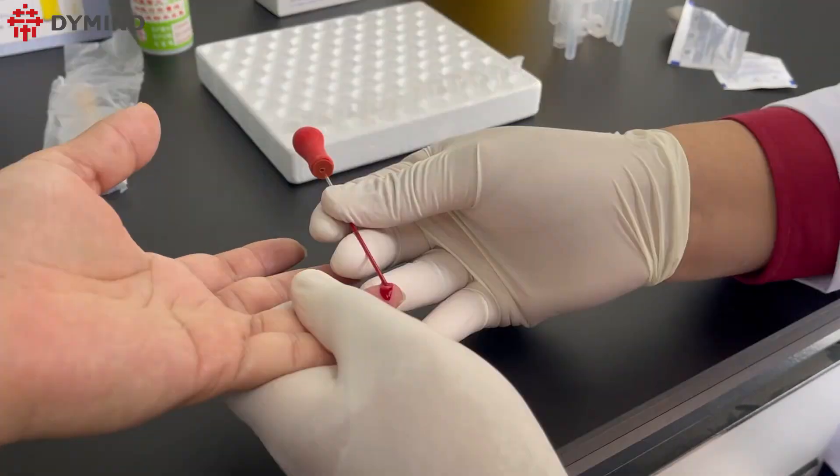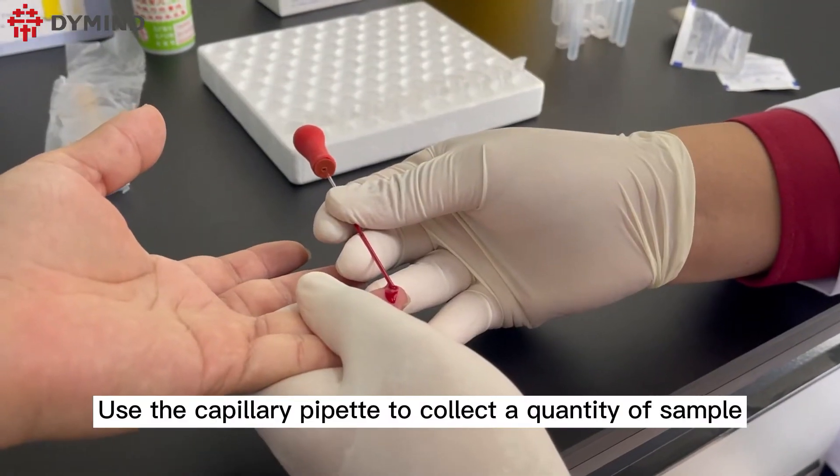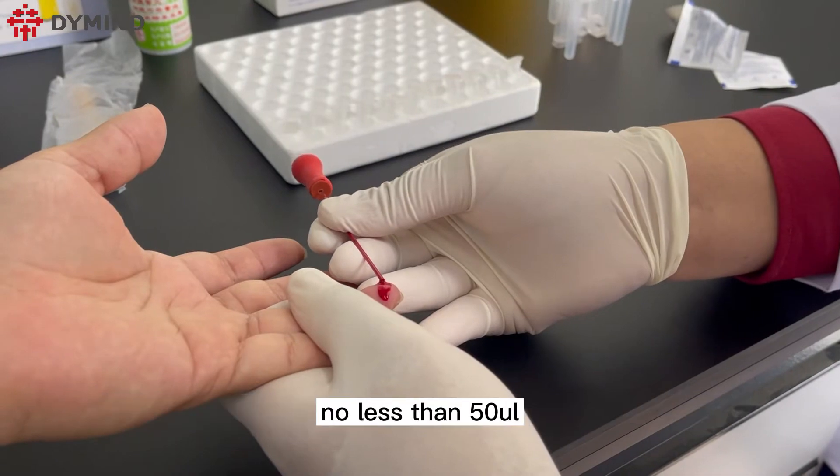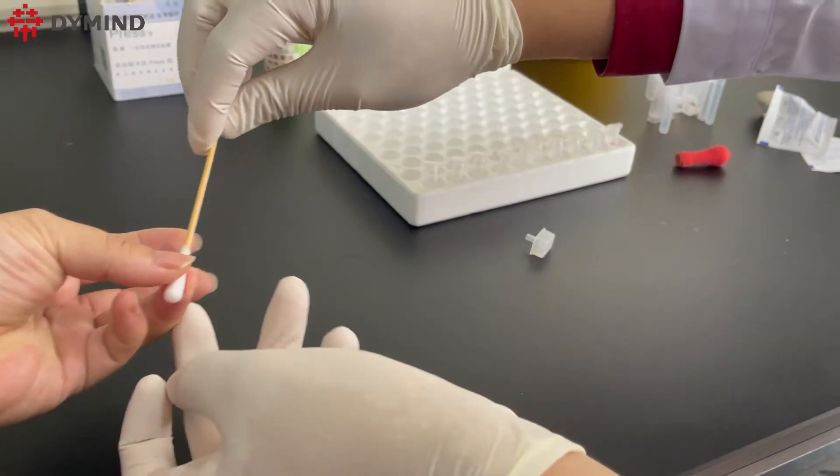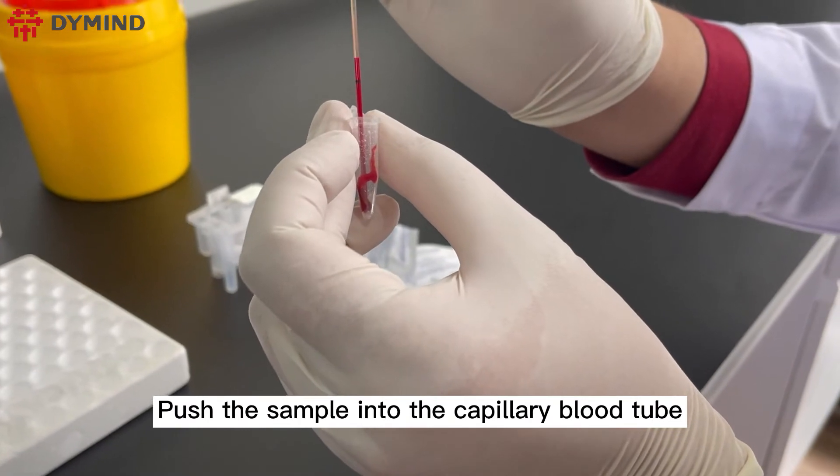Please note that the first drop of blood must be erased. Use the capillary pipette to collect a quantity of sample no less than 50 microliters, then push the sample into the capillary blood tube.